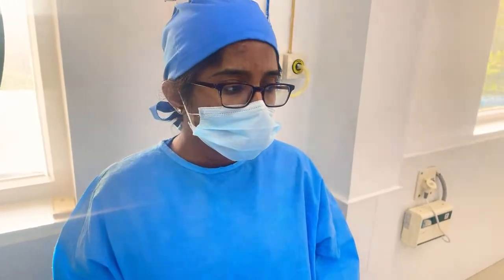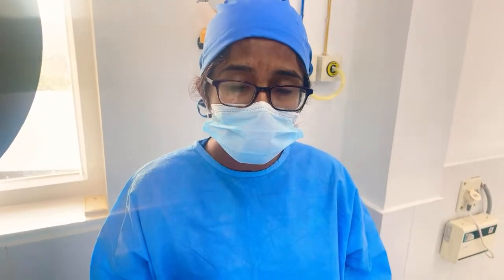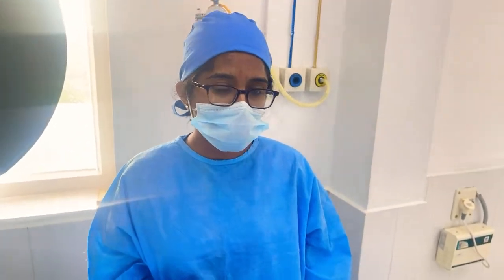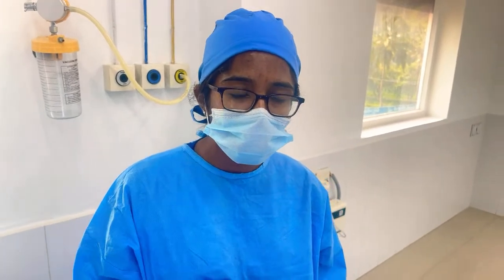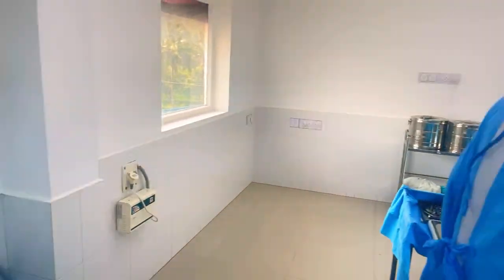Now, with the help of something called an Alice forceps, we hold the chin segment because it's quite unstable. We have even published that as an article publication in some international journal, where we hold the osteotomized chin segment, stabilize it and then fix the segment into the desired position. That's what is happening now.